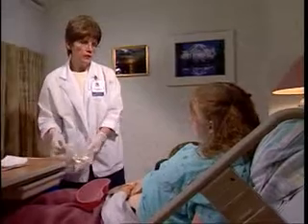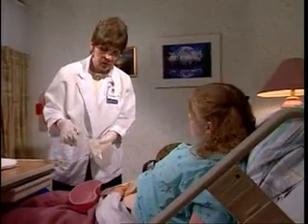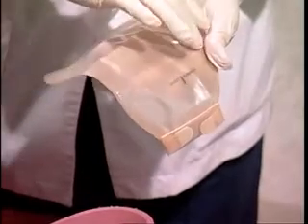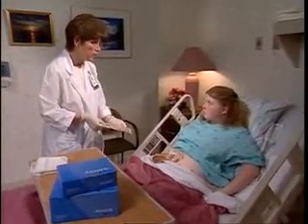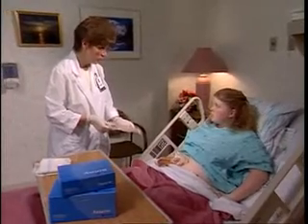One of the first things your ostomy nurse will teach you is how to empty your pouch. The best time to empty your pouch is when it is one-third full, or whenever you feel it is needed for comfort or convenience. However, it's best not to allow the pouch to fill more than halfway, since this can make emptying the pouch more difficult.